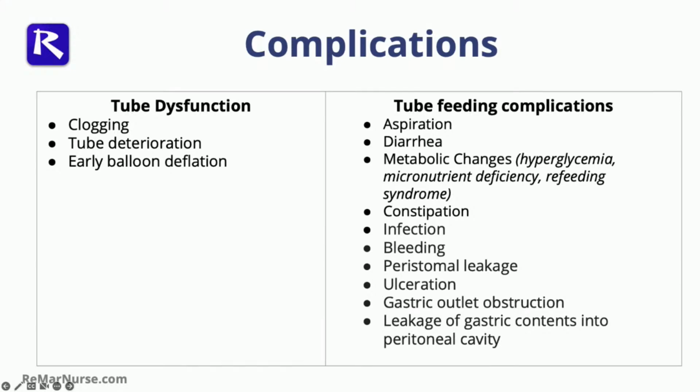And so if a tube is deteriorating, we need to replace that tube. Hopefully it's mature enough for us to do that. Yeah, also leaking too. Absolutely leaking too. And that is going to denote that it's time to change that tube.